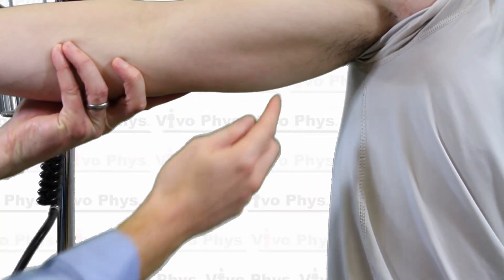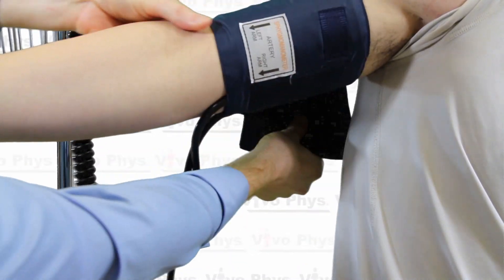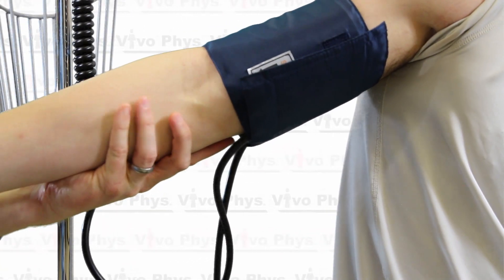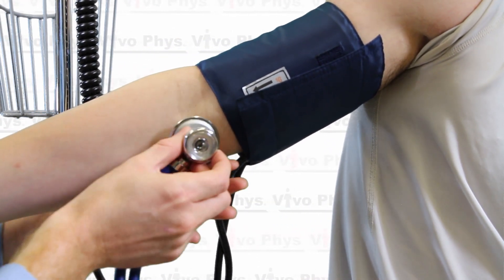When applying the blood pressure cuff, make sure the artery marker lines up with the brachial artery. Keep in mind that the brachial artery in the upper arm is on the inside between the bicep and tricep, while in the antecubital space where you'll place the stethoscope it's a bit more toward the front of the arm. Wrap the cuff fairly snug — tight enough so it doesn't slide off, but not so tight that it cuts off blood supply before inflating.